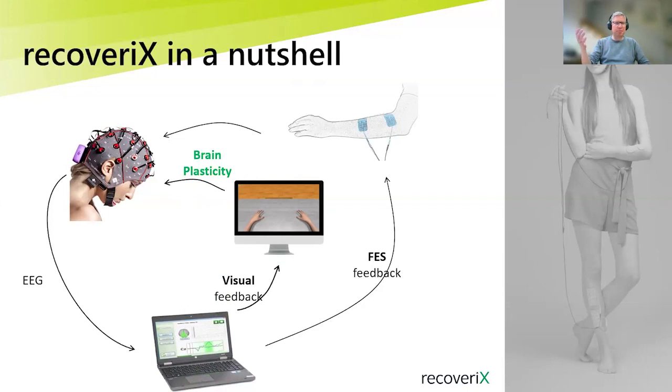And of course, that's what you heard already several times today. That's how the feedback loop is closed. You apply brain plasticity by stimulating the nervous pathways back to the brain while you're doing the motor imagery, and elicit the Hebbian plasticity to relearn the correct movements.